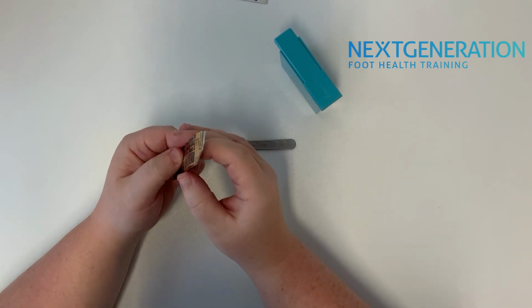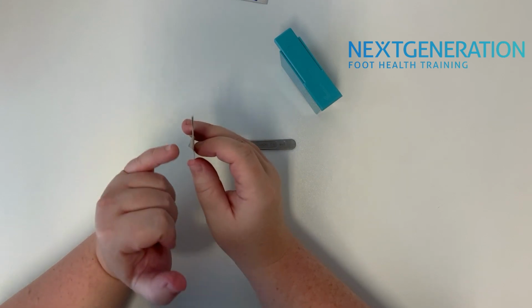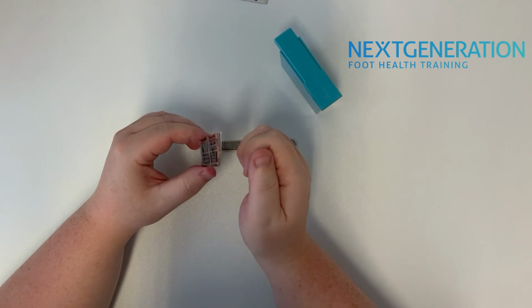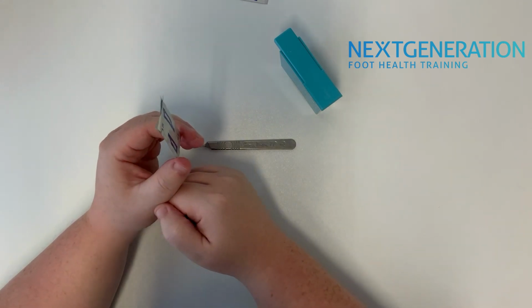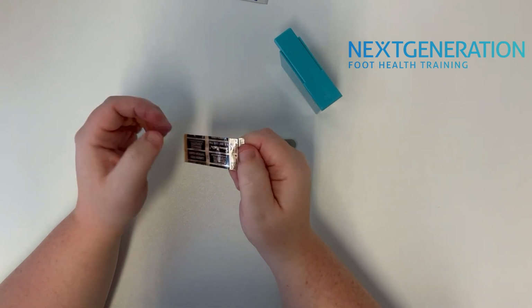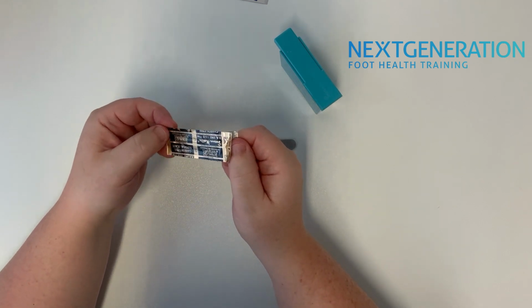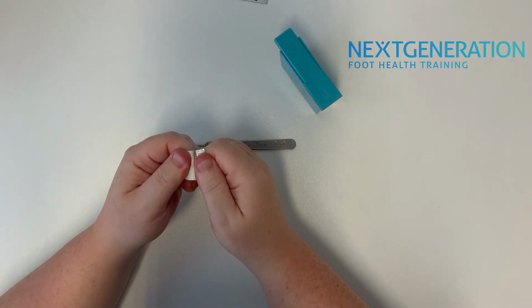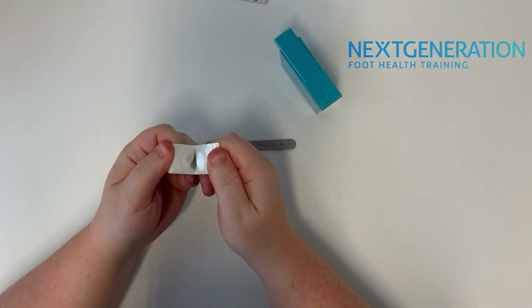So if you are left-handed, you'll need it silver side to your left and gold to your right. But as most people are right-handed, we'll do it gold side to the left and silver side to the right, because I'm right-handed as well, but I can teach it left-handed. I just have to be very careful. So it's really important, if you do attend the course, if you are left-handed, just to let me know, that's all.